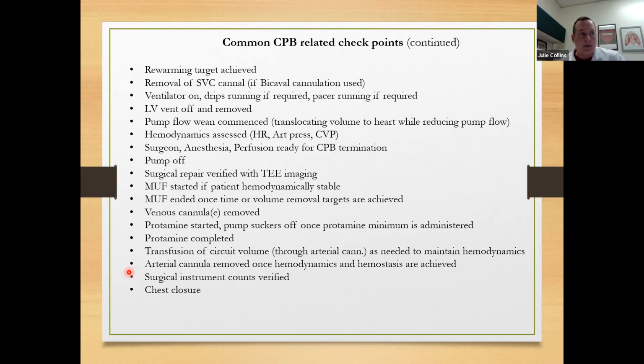You can't say, "Okay, let me go grab my coffee." You wouldn't want your pilot to do that. Your pilots go through a really rigorous checklist that makes sure everything is ready to go. You as perfusionists have to do that as well. Just because you set up the pump perfectly yesterday doesn't mean you did that today. And before each case, you've got to make sure your pump is safe and ready to go.